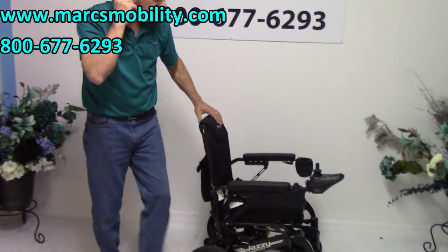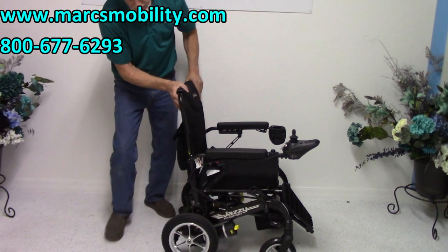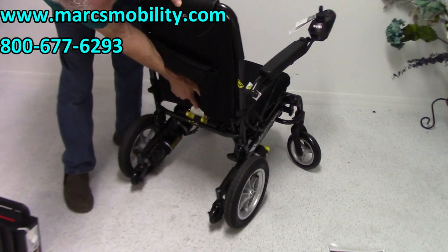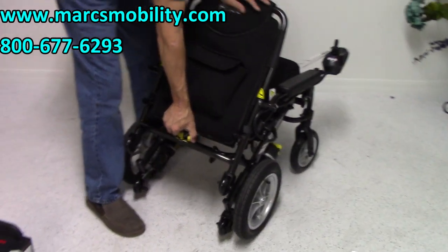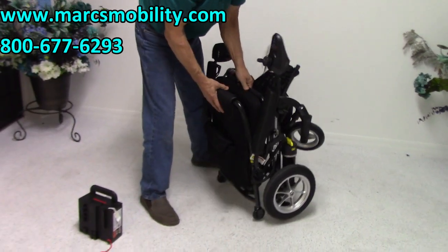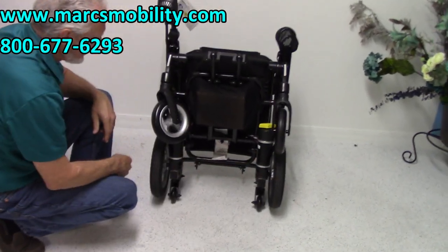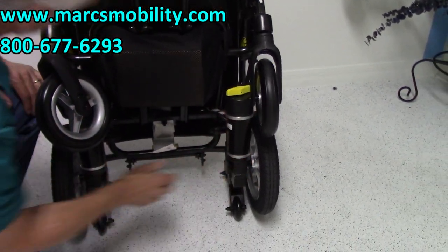Now let's see how we fold this power chair. First, fold the foot plate up. Behind the power chair there is a storage pouch where you can keep your charger. Right below there, you'll see two yellow handles — if you squeeze those and fold the seat forward, pushing down, you'll hear it click. The chair is now folded up. You can see the castor wheels in front, the drive wheels in the back, and the actual cylinder motors going to each wheel.